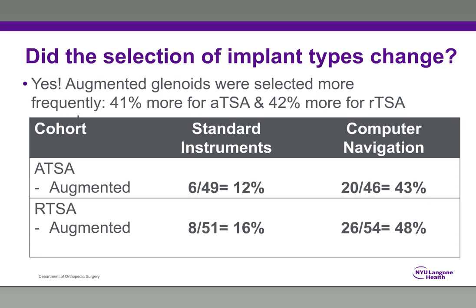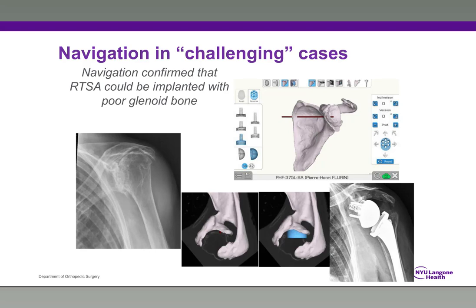Dr. Florin in France has found the same thing. With navigation, you are more likely to use an anatomically augmented implant. But what about the general experience with navigation? Let me say that I use navigation in every case now because I think it's been helpful. As I said, it made me a better surgeon.